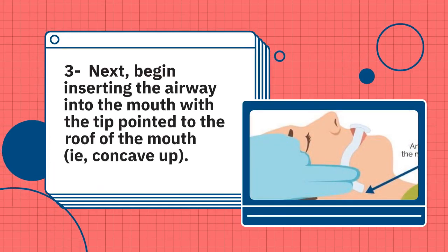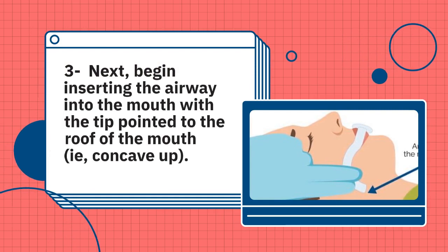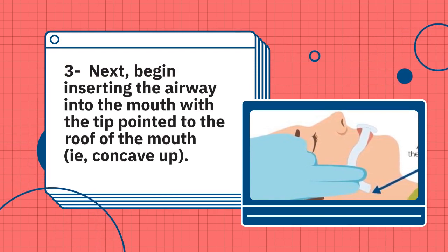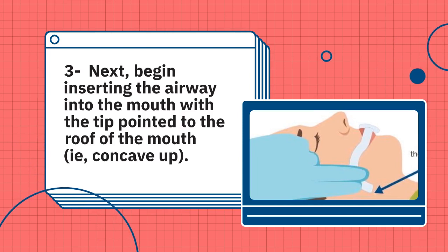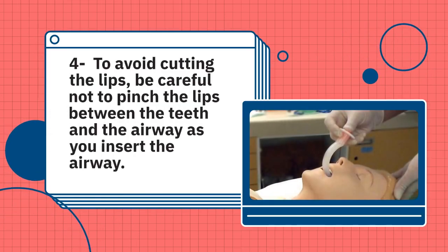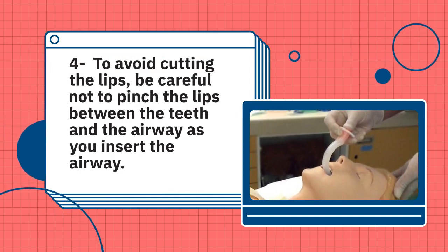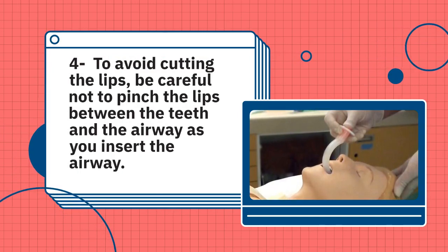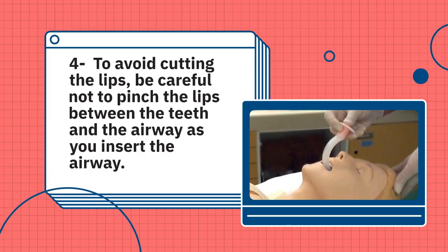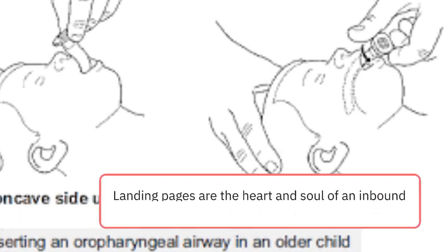Complications of oropharyngeal airway: airway obstruction by an improperly sized or improperly inserted oropharyngeal airway, gagging and the potential for vomiting and aspiration. Sizing the airway: choose the correct size by measuring the oropharyngeal airway against a patient's face. When the tip is placed at the angle of the jaw, the flange should align with the center of the top teeth, i.e. measure hard to hard.